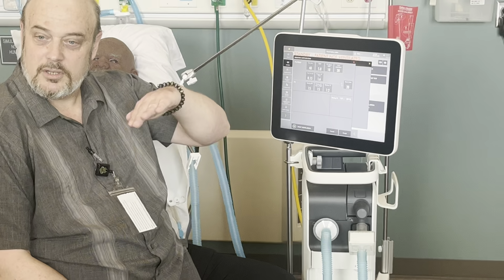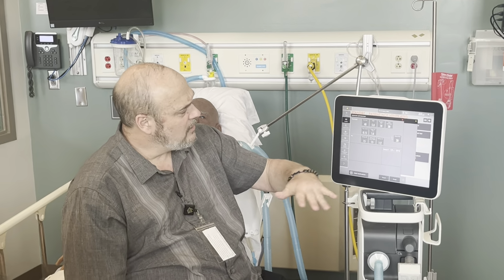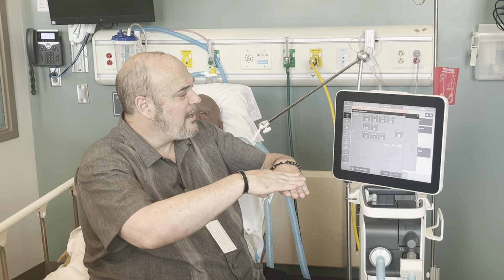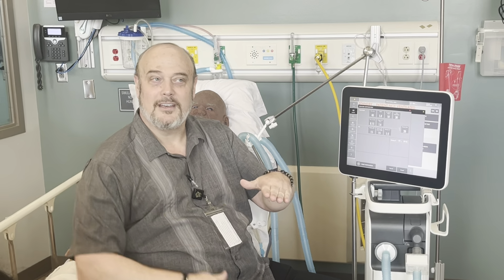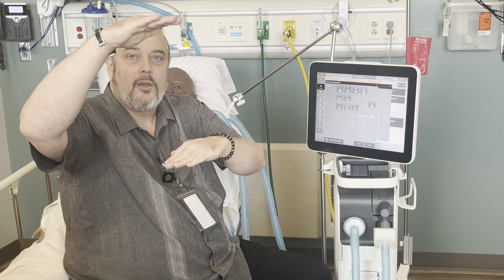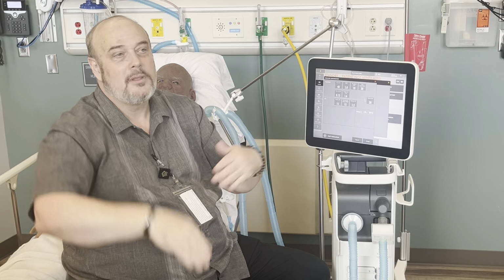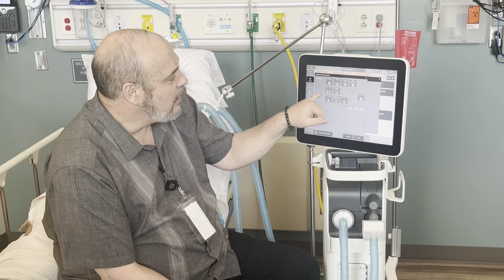So this one tells you the CPAP level, and then it tells you the pressure support, right? We're gonna do a PEEP of 5, and then I'm gonna do 10 above that. But my peak pressure is gonna be 15. The other one wants the IPAP, which is 15, and the EPAP, which is 5. What happens when you subtract the EPAP from the IPAP? You get pressure support, right? So just be mindful of that.